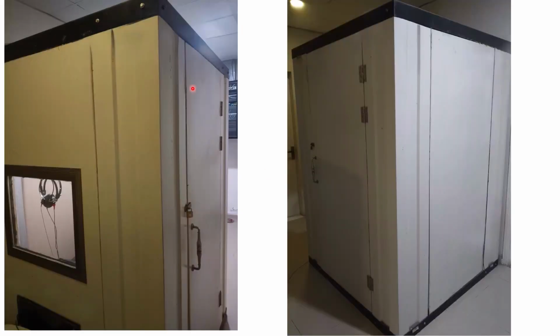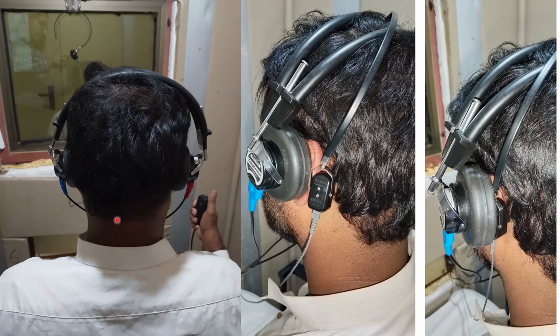So this is a soundproof booth, and these are the headphones and bone vibrator here. The patient is seated and headphones are attached. The colors are marked: red for the right side and blue for the left side.